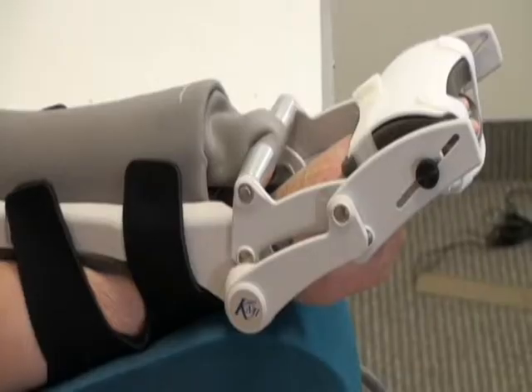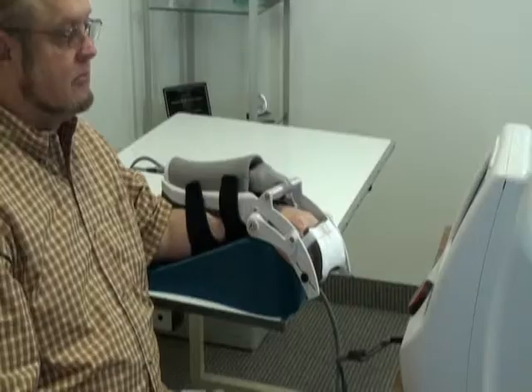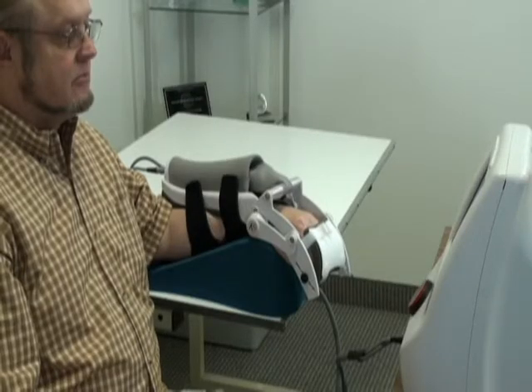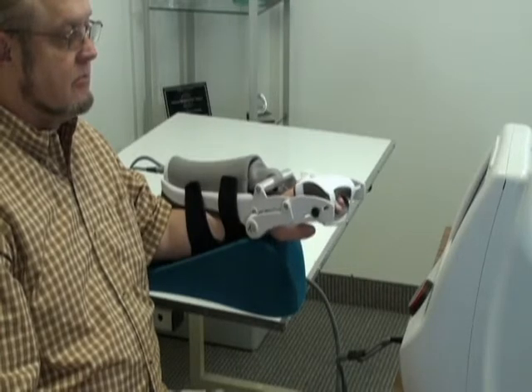Initially, the patient's hand is raised to a wrist angle of 35 degrees. This may be less if the patient exhibits high tone. The air muscle will stop inflating if it senses high tone in the patient's flexors.